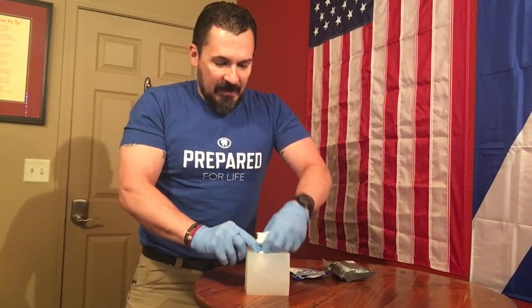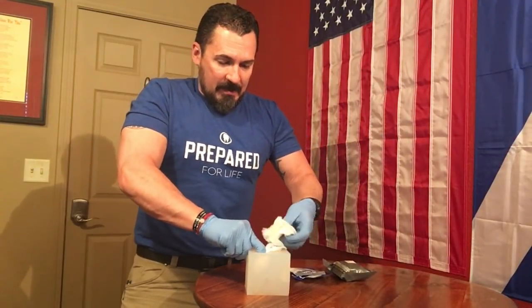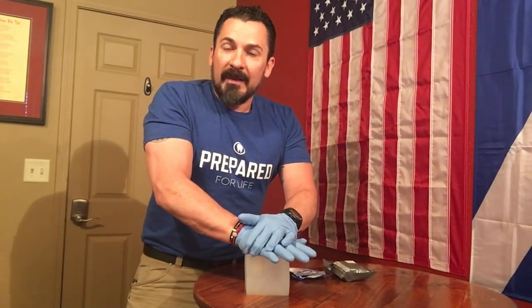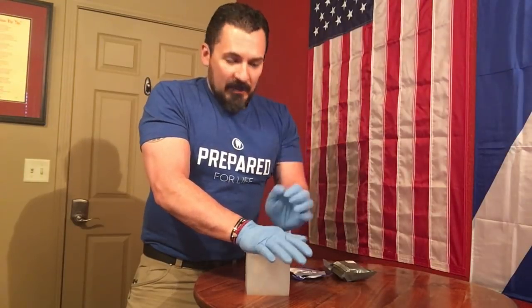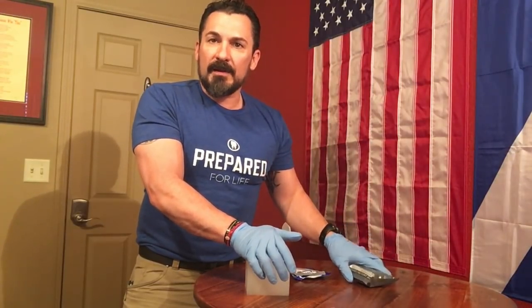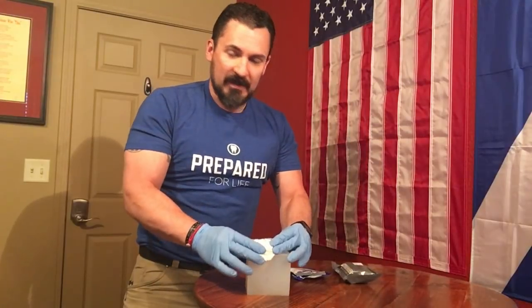Now let's just say I've got this wound completely packed. No more material is going in here. I'm going to then utilize the rest, put it on the outside, and hold pressure down there for the recommended time. That's 2 to 3 minutes for QuikClot. And then once that time is expired, I'll look around the edges, make sure it's not re-bleeding. And then at that point in time, I'll get my pressure bandage out and reinforce with that pressure bandage. Always, always, always reinforce any kind of hemostatic agent with a pressure dressing.